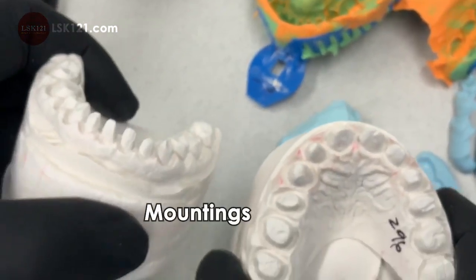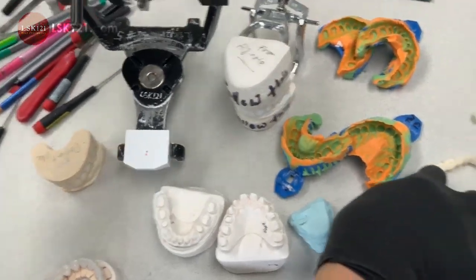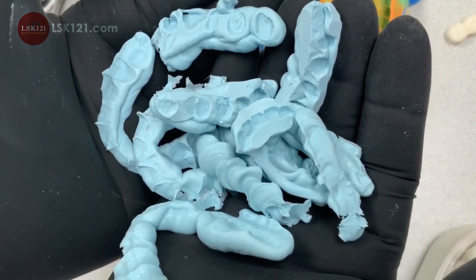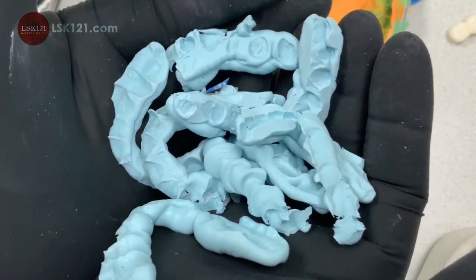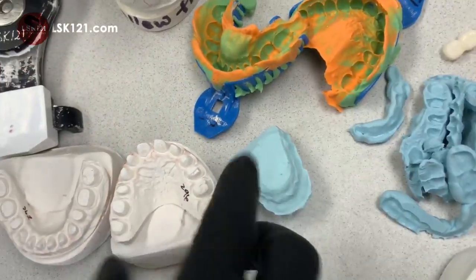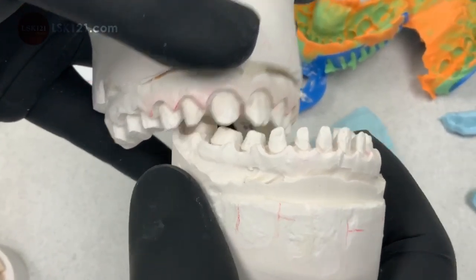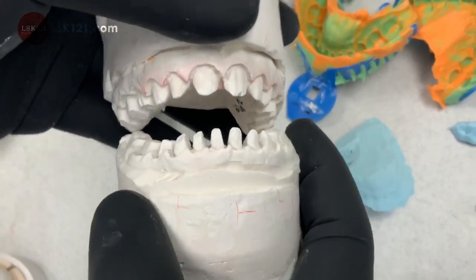We mounted it with the articulator, and we have a lot of bite blocks. We recommend centric bite — take the bite on the right side with the temporary, and the other side without the temporary, like a cross-bite setup. If you have any questions, let us know — I can explain in more detail. For example, when they prep the teeth, they're losing the vertical so they don't know which position they're in.